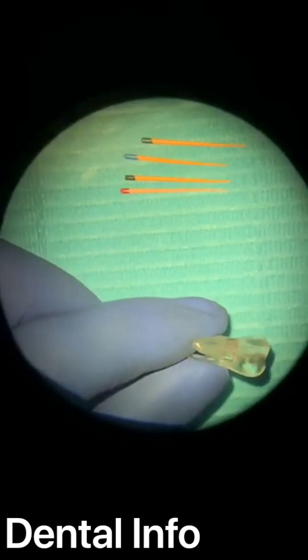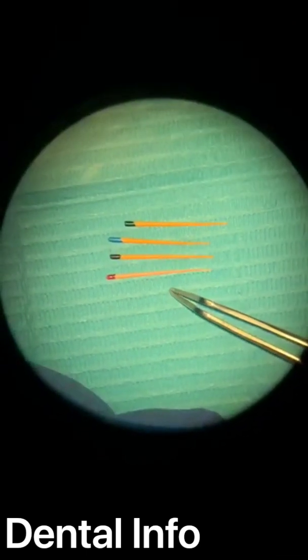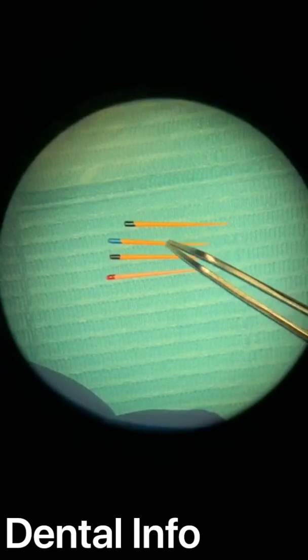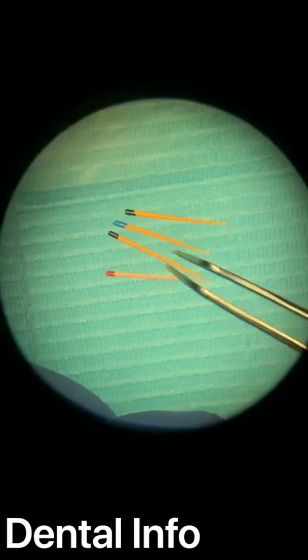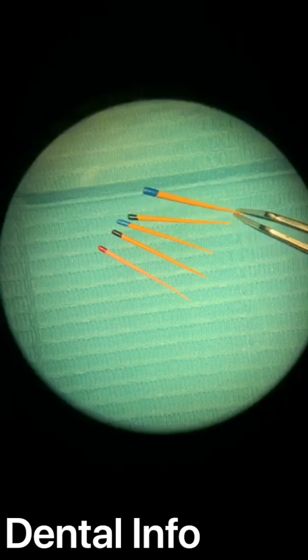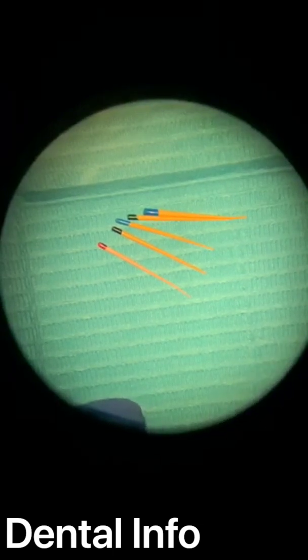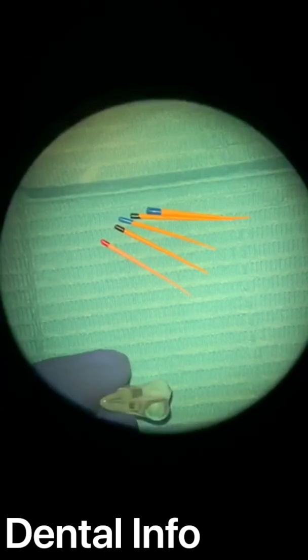And for that, I'm here now and you see here different sizes of gutta-percha. We have here 25/04, we have 30/04, we have 35/04, and we have 40/04, okay? And we have here 30/06, okay? We will make the demonstration on all these to differentiate the good tugback from the false tugback, or real tugback from the false tugback.